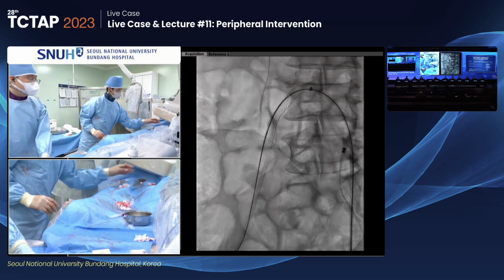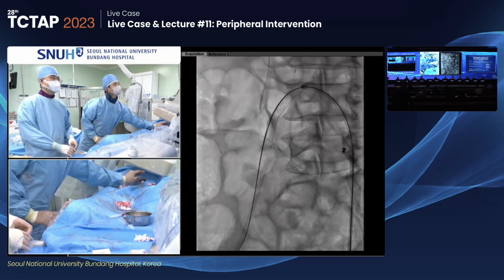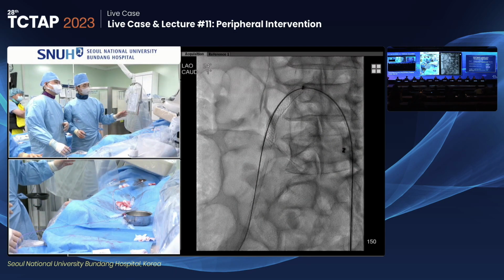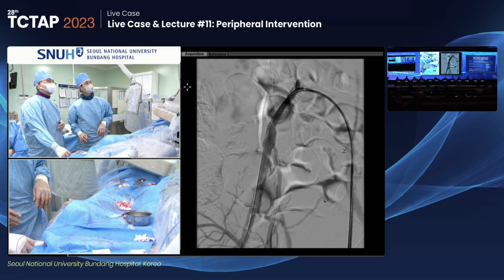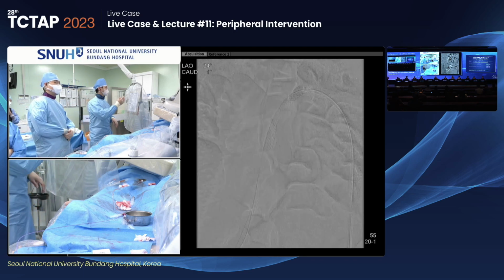Okay. We have to go to our final talk. Can we get one last angiogram here before we go? One angio, please. Nice. That turned out lovely.